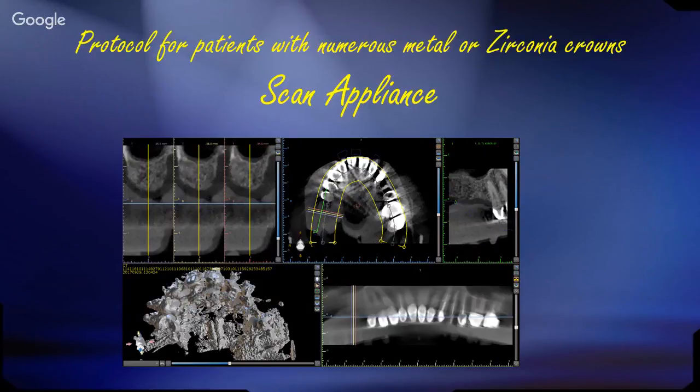If the patient didn't accept it, I would probably have done a cement-on crown on the custom abutment. But yes, with guided surgery, it allows us to do the vast majority of our cases now screw retained. Even in the premaxilla, sometimes we can augment the bone that allows us to place the implant in the proper trajectory so that we can do screw retained. So yes, the answer is that's our goal. Do we always meet that goal? No.